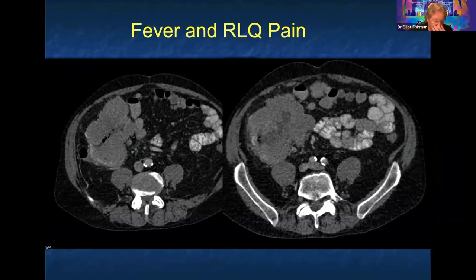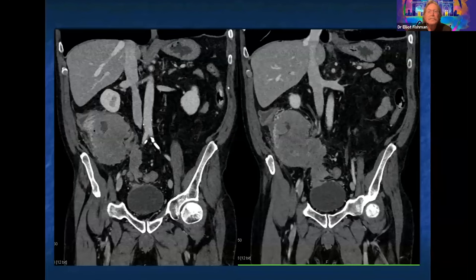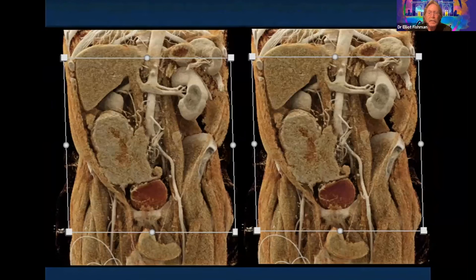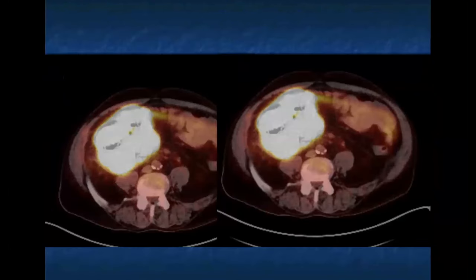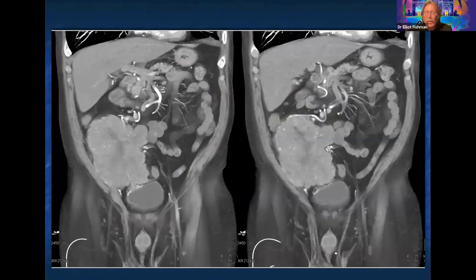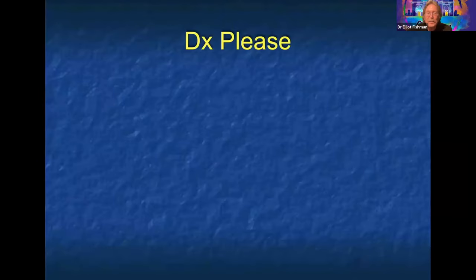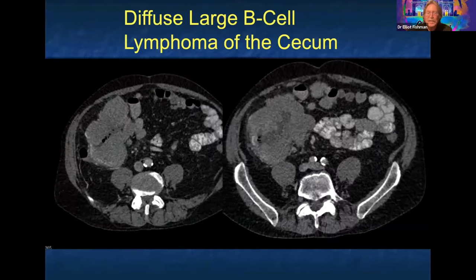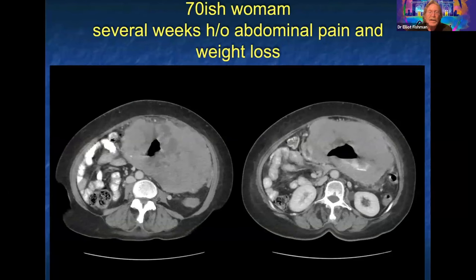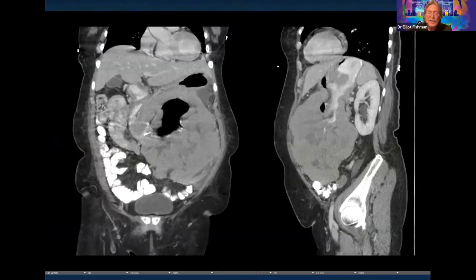Patient with fever and right lower quadrant pain. Answers: appendicular mass, GIST, lymphoma, appendicular lymphoma, bulky tumor. This was PET-positive B-cell lymphoma of the cecum — interesting to compare the prior study showing a smaller mass versus this larger mass.